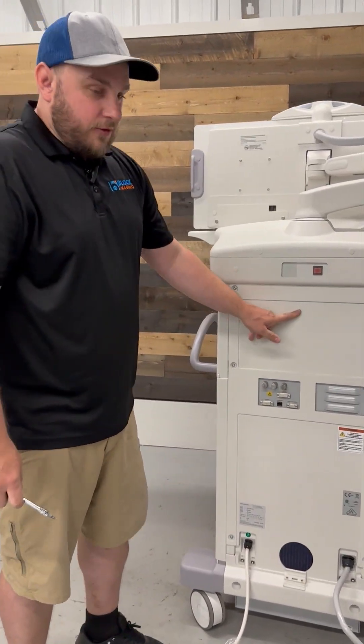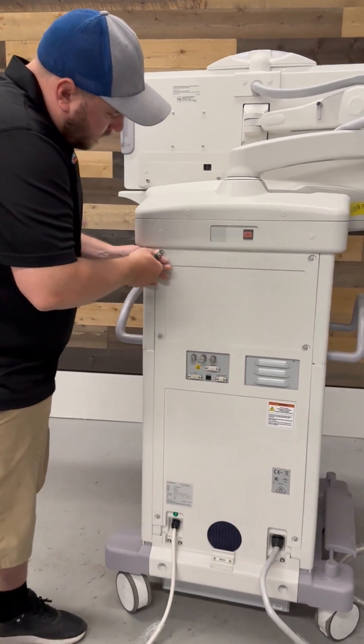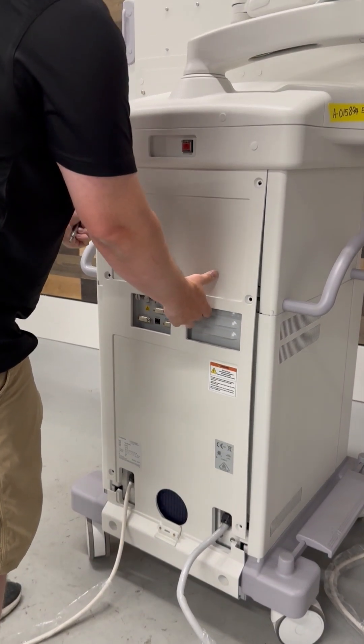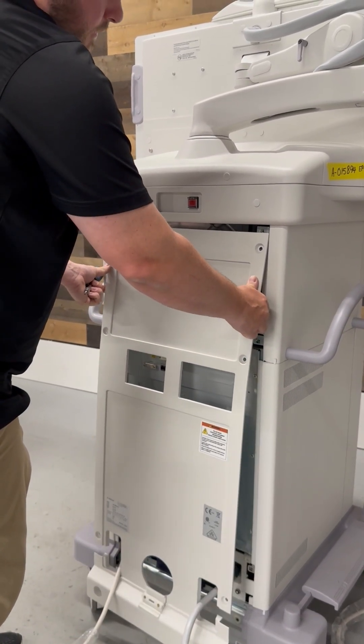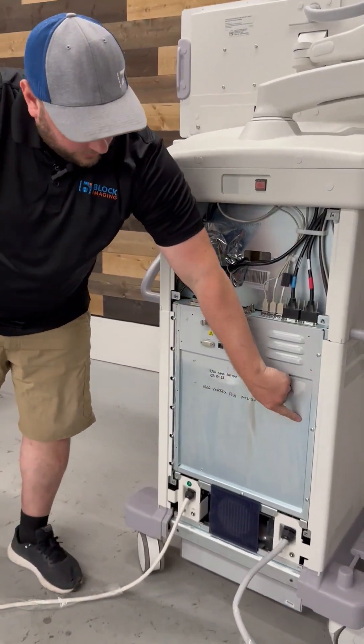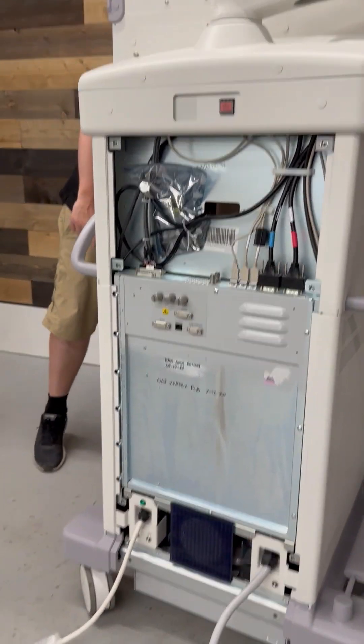First off, what we're going to do is remove this back panel on the workstation. To do that, remove eight screws, kind of flex the top of it out, and pull it off. Now that's going to expose your access panel here inside the workstation.